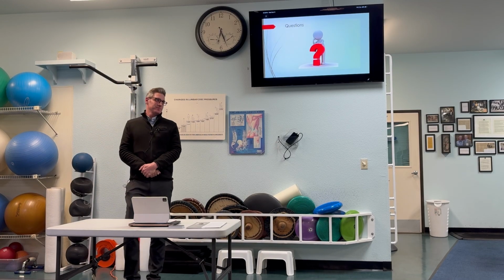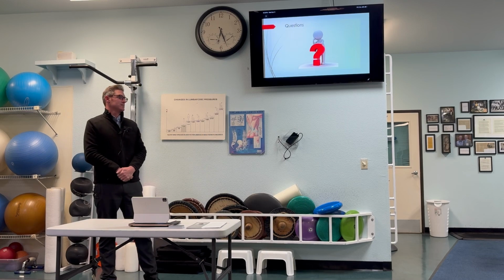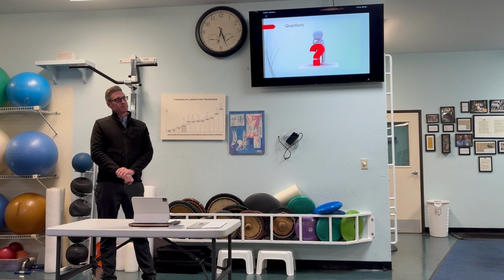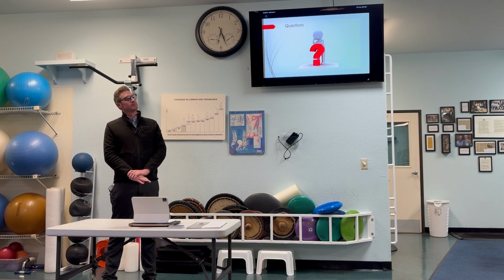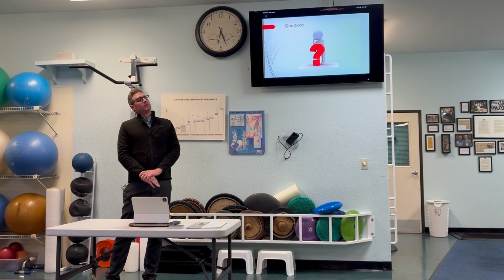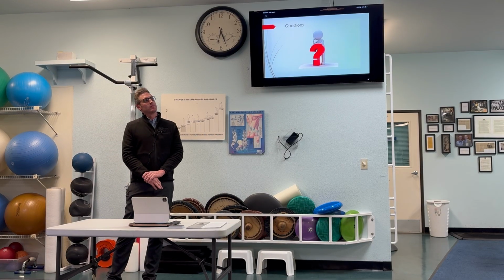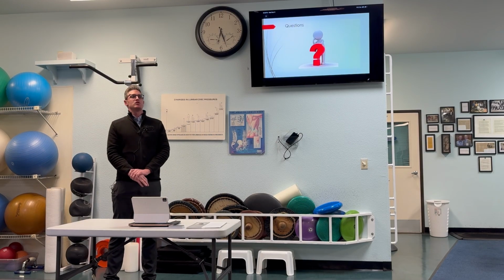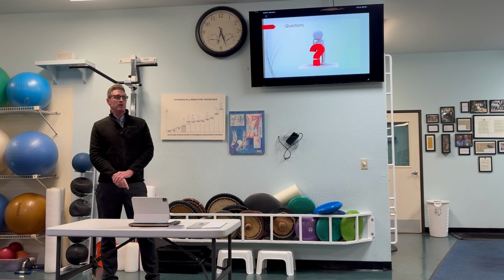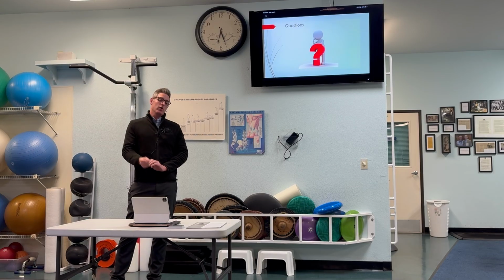Sure. If someone was to get, say, a 30-year-old, and they got a disc replacement, but then later on needed a second surgery, how would they get a fusion, and do you have any outcomes with those, like an adjacent segment? So it depends if it's adjacent segment. There are revision rates of the disc arthroplasty as well, although quite low.